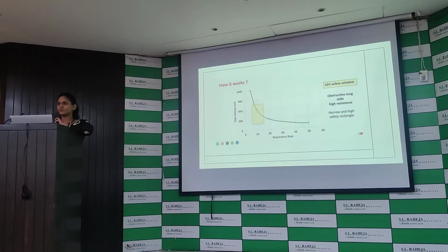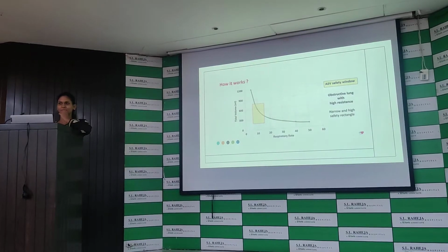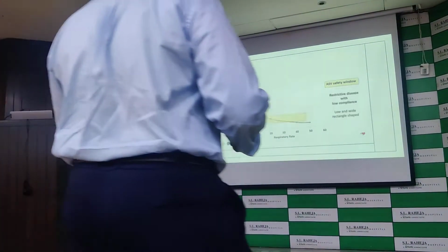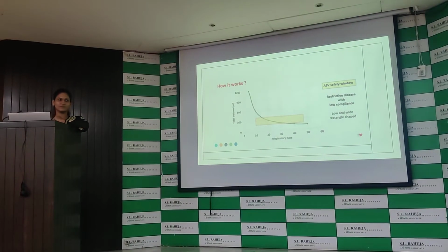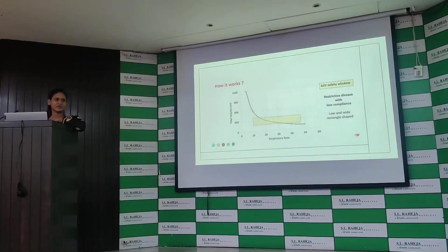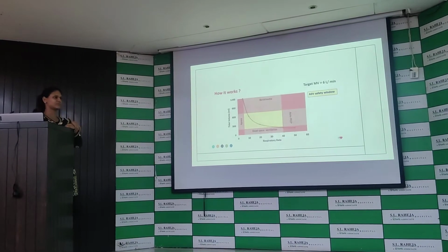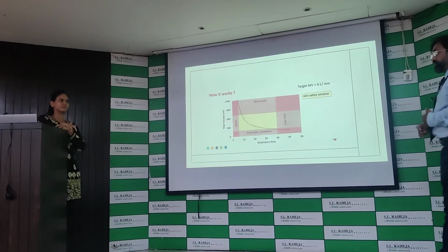So what is happening here is, if you look at it now, the ventilator is knowledge based. So what is it doing? It is actually figuring out the compliance. It is figuring out the resistance. It is doing all those things. So it is understanding obstructive airway disease. It is understanding restrictive airway disease. It is understanding all those things.